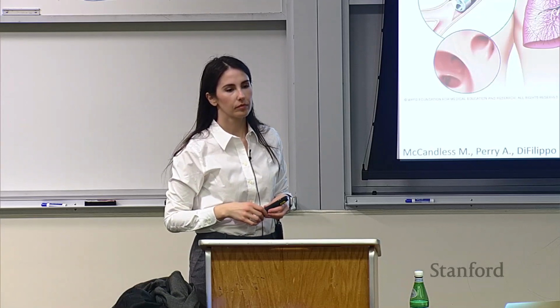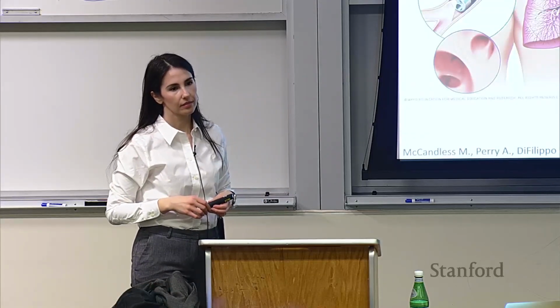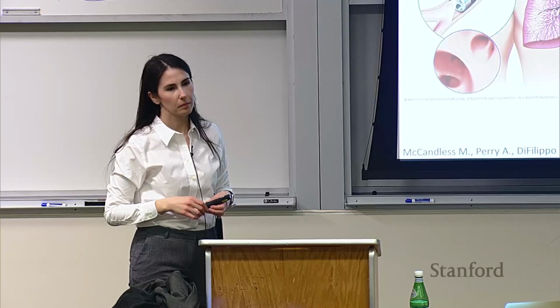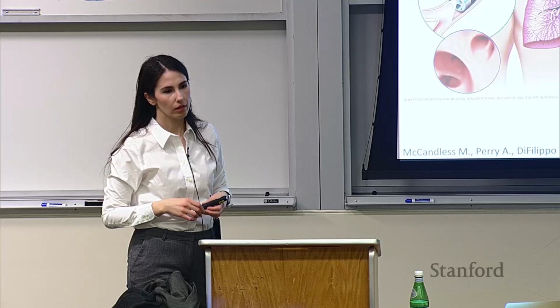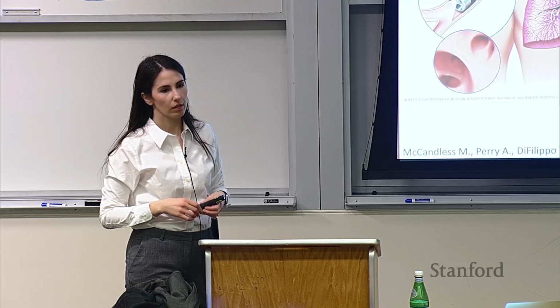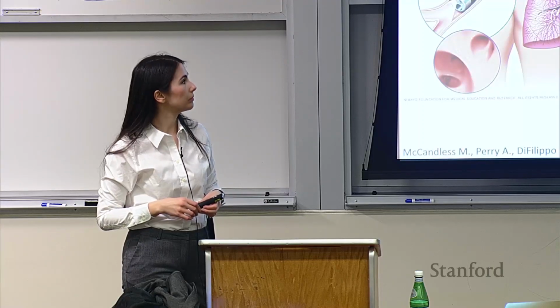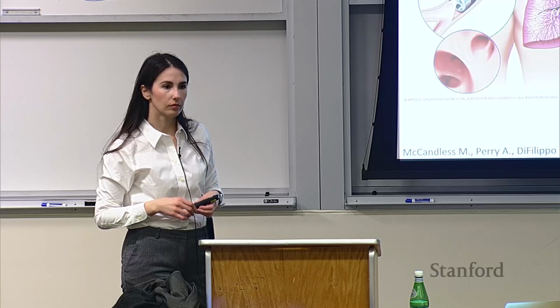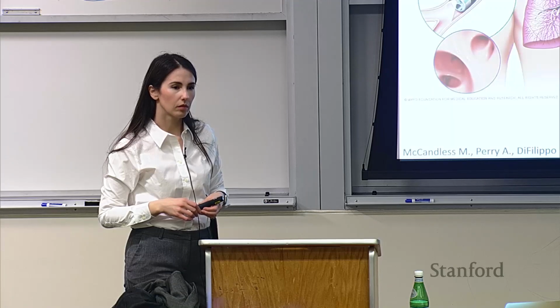I work at Intuitive, but not specifically on our Ion products, so I don't know that much about the lung geometry. I was wondering if you could elaborate. I saw your neck-down actuator, and you were talking about how most cancer nodules are deep in the lung. How does the geometry of this actuator you've created compare to those very, very small orifices at the edge of the lung? How deep does it penetrate?